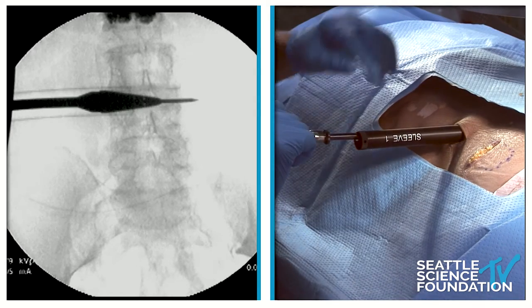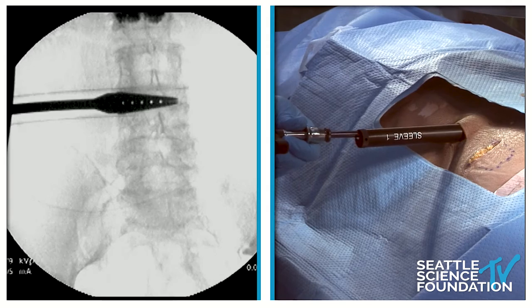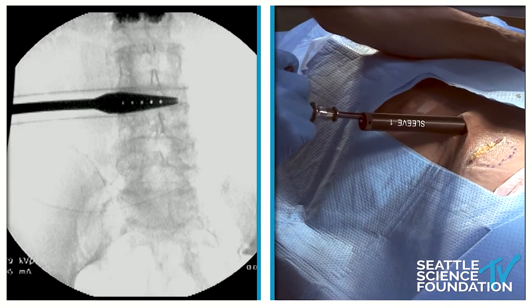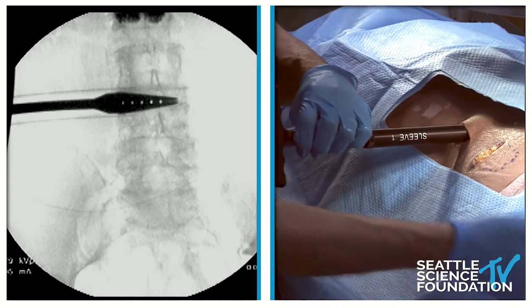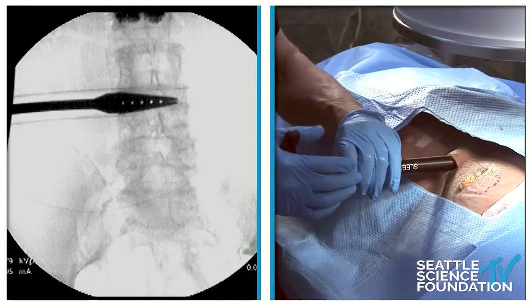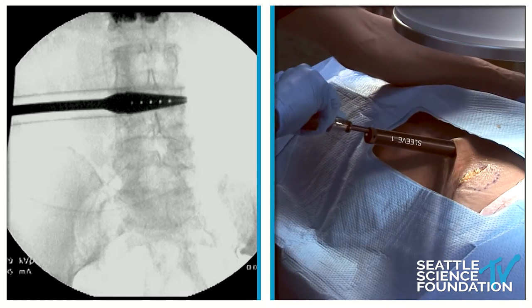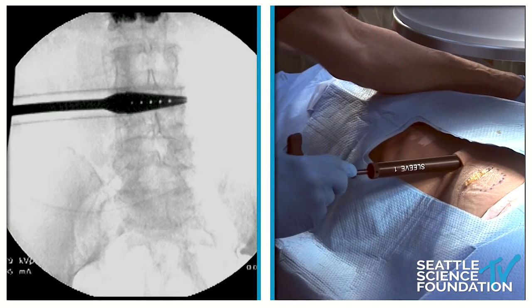I'm going to line the proximal laser line up with the II. There's a laser line here that I can see. I'll pull the wire back and you'll be able to see the holes — we're past eight, going to 10. The indications for this are generally degenerative disc disease, but the indication I like mostly is degenerative disc disease with pain and a little bit of stenosis — something like facet joint gapping, a little bit of spondylolisthesis. We're almost to the 12, and just like the sizing for the previous spacer, we're going to size past our target — a little bit past 12 to put in a 12.